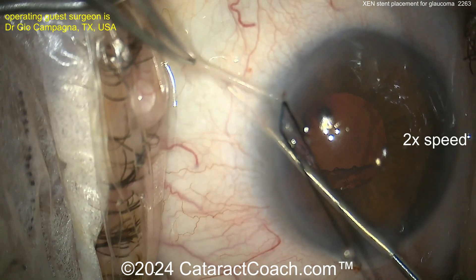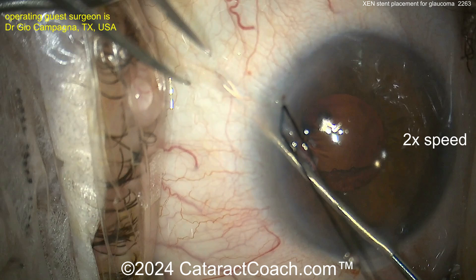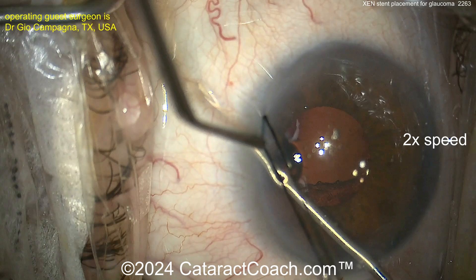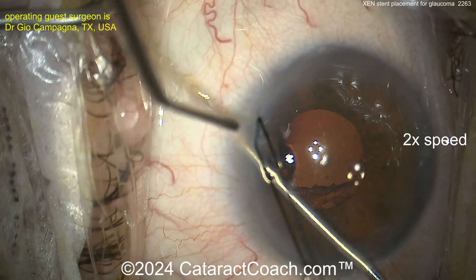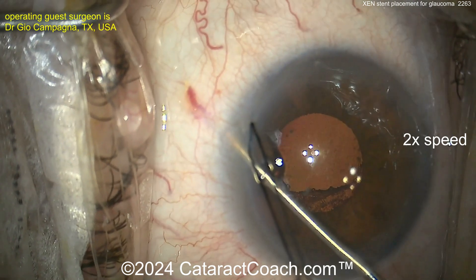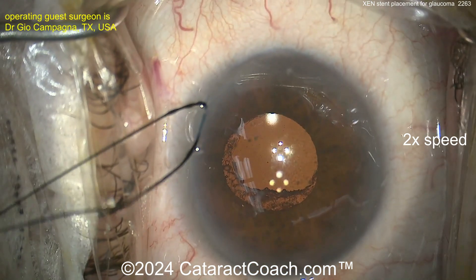Nice and easy — that's a really good-looking positioning. We're going to confirm it by putting up the gonio mirror, the gonio prism. There we go — there's the device, and that's going to create an outflow channel from the anterior chamber into the subconjunctival space.